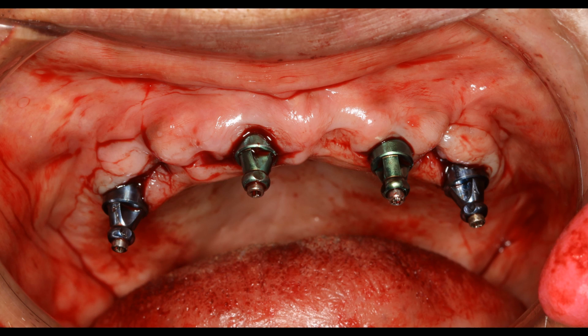This is 2 months after the initial surgery where we uncover the implants. These are impression copings that we use to index the position of the implant to get ready for the temporary bridge. And because the implant caps were slightly showing through the tissues, my incision could be very minimal in the upper arch, just basically enough to expose the implants. And again, going back to that valuable, important, precious tissue, this is all the connective tissue that we were able to maintain by not removing bone and not removing tissue.